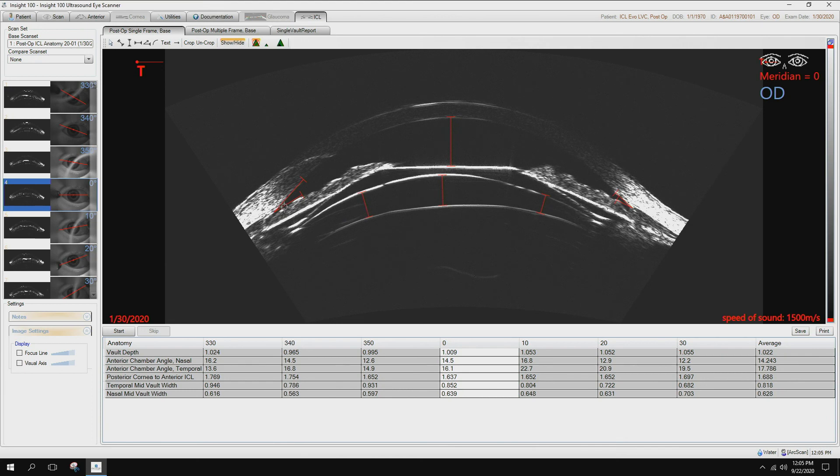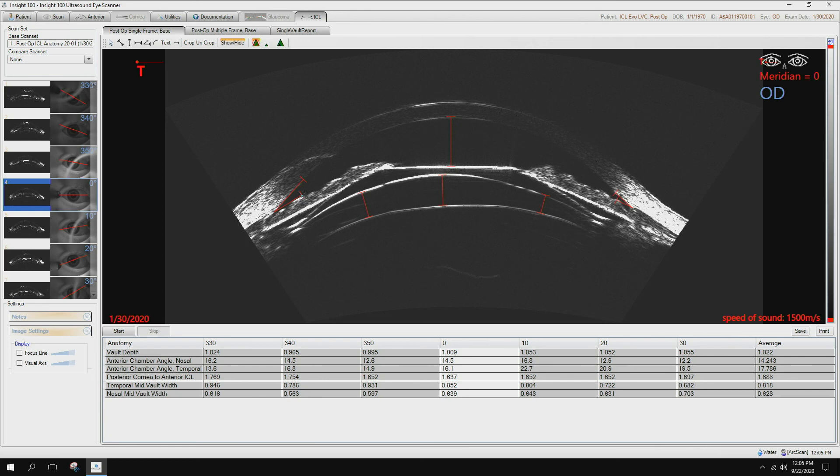It's very critical because of the proximity of the lens. Here you have the angles, so you can compare pre-op angles to post-op angles. As long as you're, what we're hearing, above 15 degrees on those angles, your patient's good to go.